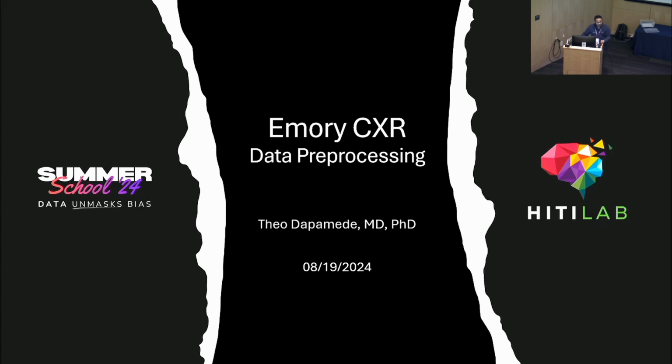Dr. Van Assen has given us a really extensive introduction and talk about all the chest X-ray imaging pipelines, and also what to think about when we want to model our data. This talk is mainly looking at the DICOM images and how you would load them and then work with them. By the end of this talk, I hope that you can be more comfortable in actually accessing all the DICOM tags, data elements, loading the images and doing pre-processing.